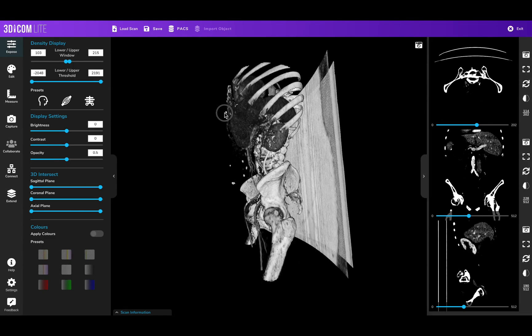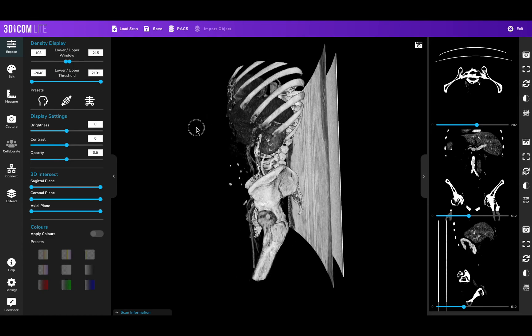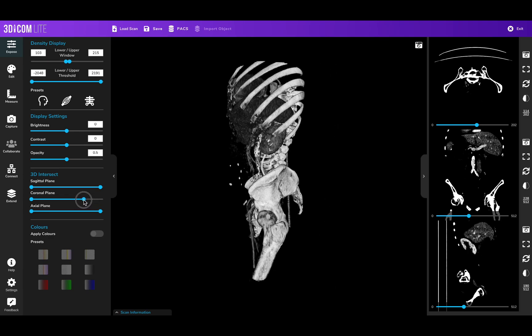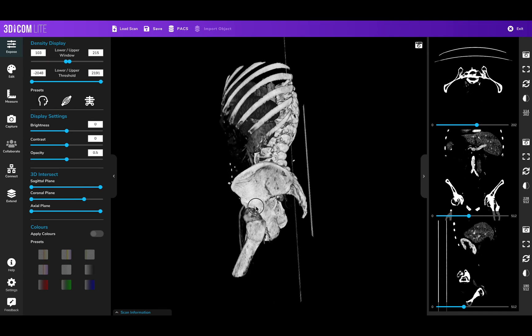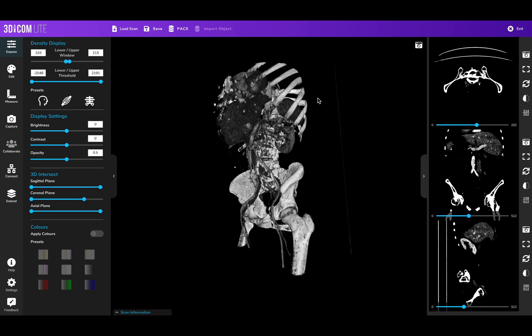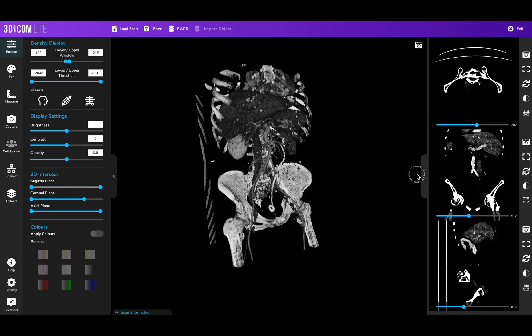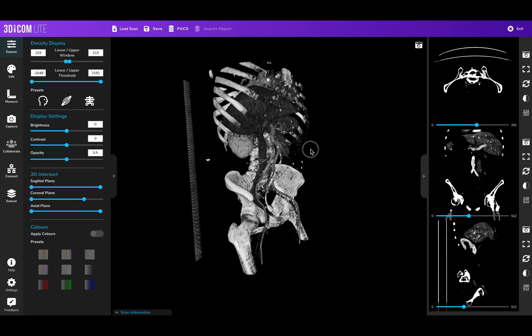What's also nice to do with some of these scans is to remove the CT scanner bed by changing the coronal plane and bringing it just to where it starts to cut into the patient anatomy, so that you're left with very few artefacts in the scan. You can then click on the camera and capture these scans.